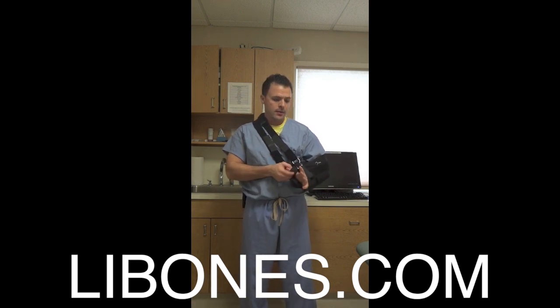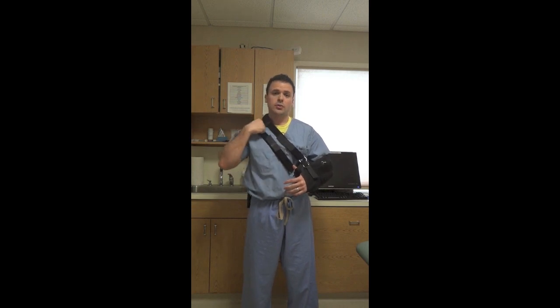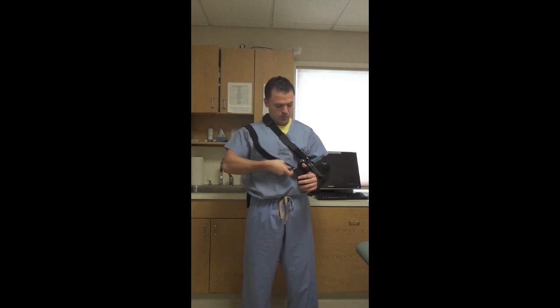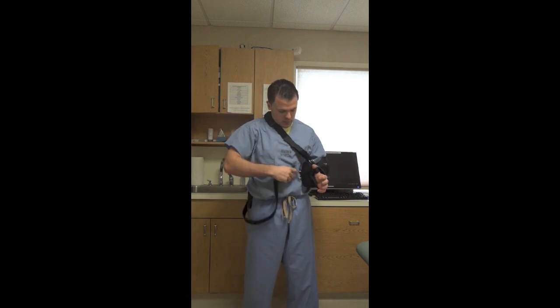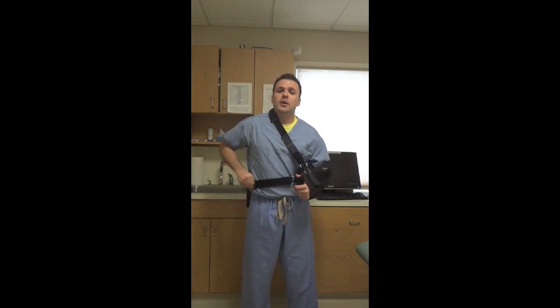Make sure your thumb is in the loop that is right at the end of the sling. One option for placement of this sling is the strap that goes around the shoulder — not the one connected to the top of the sling, but the one connected to the pillow. You can adjust that by undoing the Velcro strap, going underneath the arm around your torso, and reconnecting it to the same loop. Some people find it's more comfortable to have it around the waist than around the shoulder.